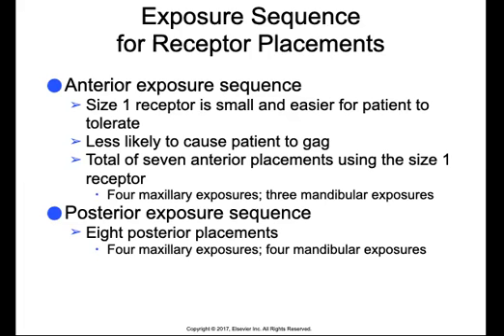You'll always begin with the anterior teeth, and then, like I said before, stick to a sequence and don't interchange the sequence from patient to patient. You'll just get confused and you'll forget which teeth you've taken a picture of and which ones you still need to. So you want to make this a habit for all of your imaging exposures.